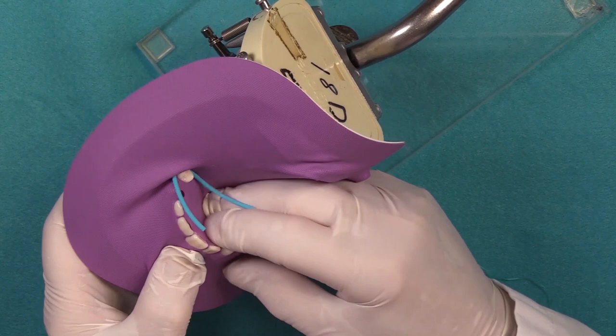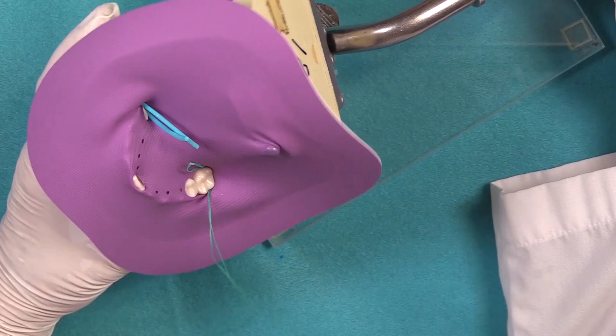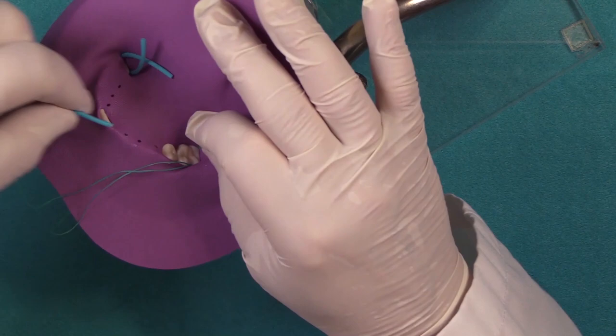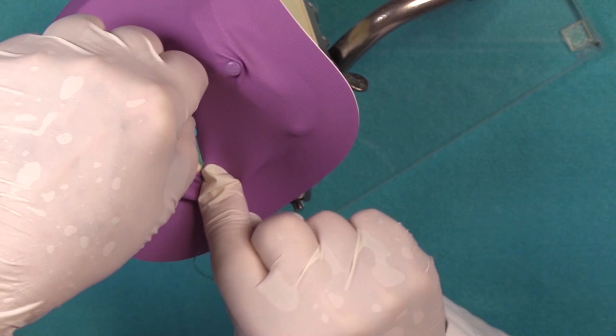If the contacts aren't too tight you can actually slip the dam in between the teeth. I'm going to show you a little trick. If you fold the floss over and you get your wedged cord into the loop like this and fold it over, you hold the wedged cord. Now you're going to pull the double strand of floss and you're going to pull the wedged cord through that way.